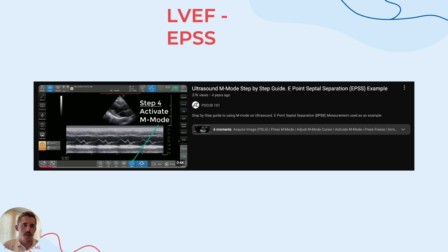So here we have a YouTube link. I think it'd be awesome if you guys are watching this to go check out from POCUS 101. It's just an EPSS example running through step by step on an actual ultrasound machine. So if you pull this up next to your ultrasound and your patient while you're doing it, maybe not your patient, maybe someone you're practicing with, and then go into your patient, it's a great way to get those physical correlations with what you're actually doing and the material that you're learning here.